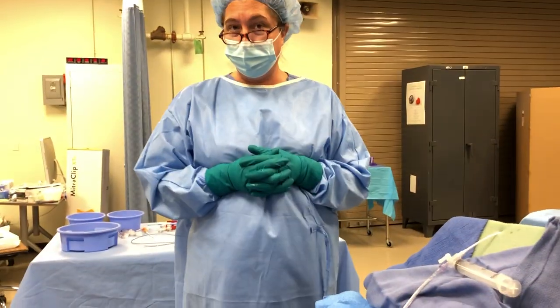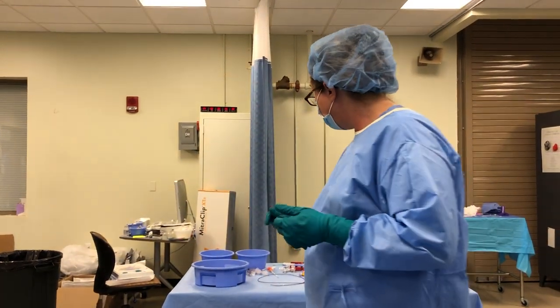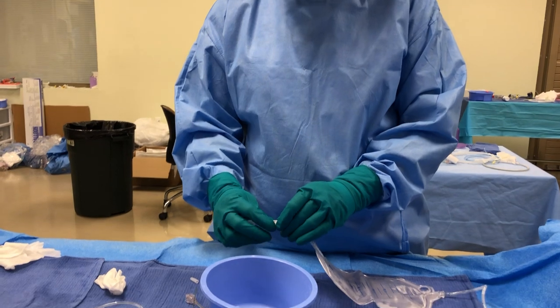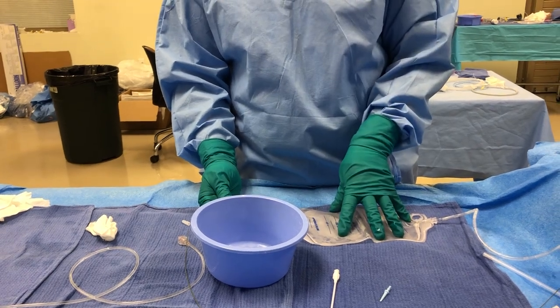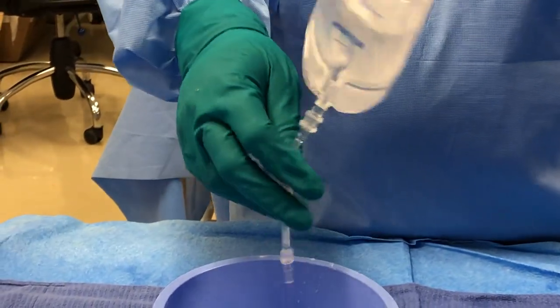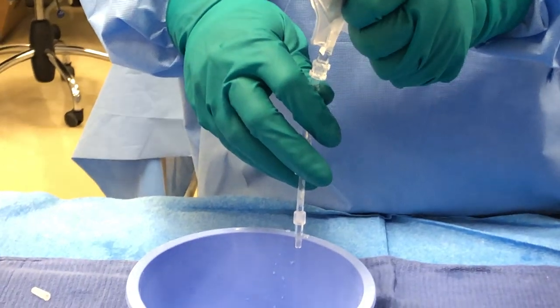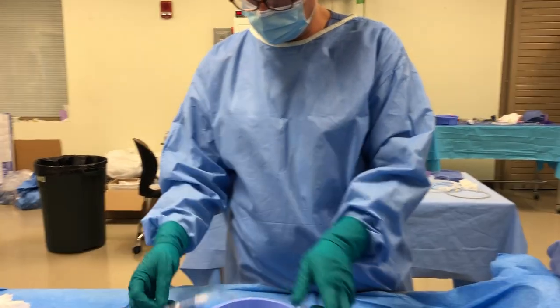Now if you ever did have to empty the bag — there's a little cap on the end, take it off, unclamp it. The reason we clamp it is so blood doesn't leak while we're filling the bag. Unclamp it — very similar to the clamp on our FemStop — and then we can just empty the bag, letting gravity do the work. By that point your patient's probably pretty stable. Reclamp and put the little cap back on.